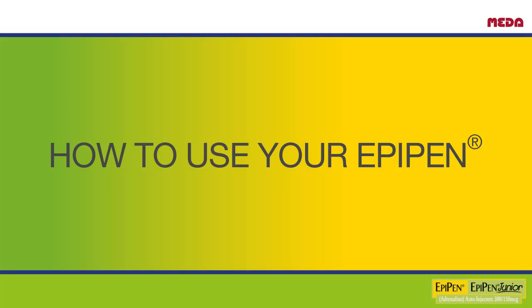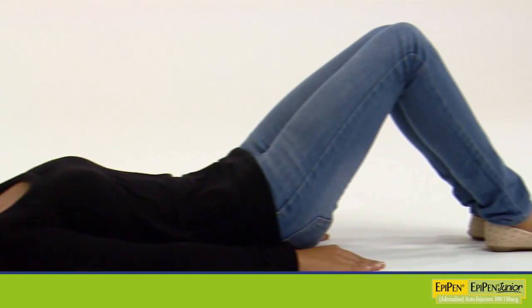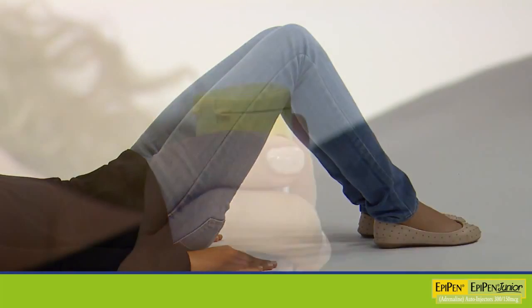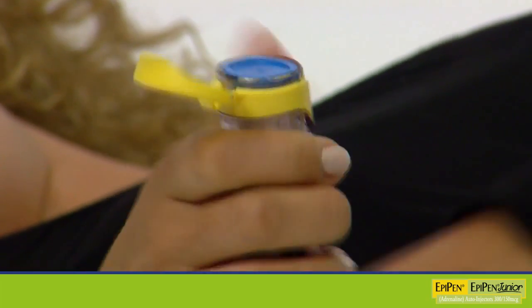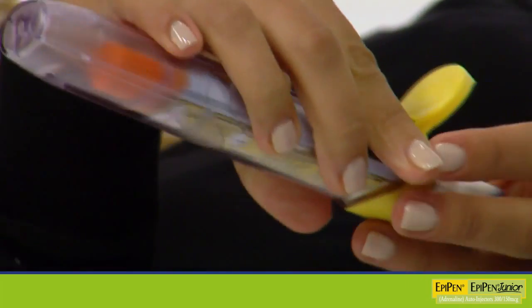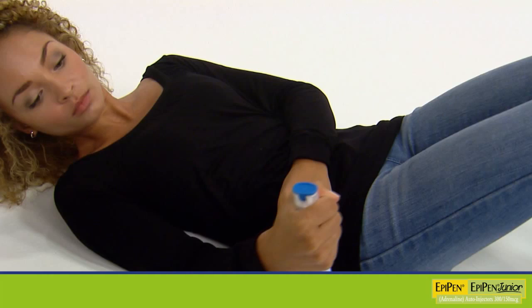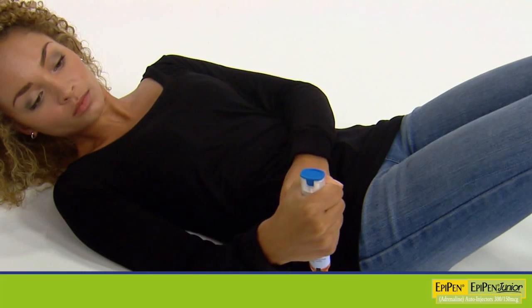Using your EpiPen is easy, especially if you practice with your trainer pen. There is no need to remove clothing, but make sure the orange end will not hit buckles, zips, buttons, or thick seams. To remove the EpiPen from the carry case, flip open the lid and slide the EpiPen out. Grasp the Auto Injector with your thumb nearest the blue cap and form a fist around the unit. With the other hand, pull off the blue safety cap.